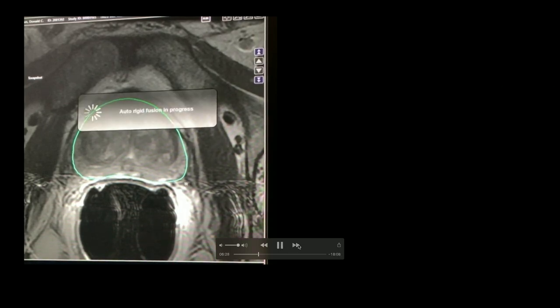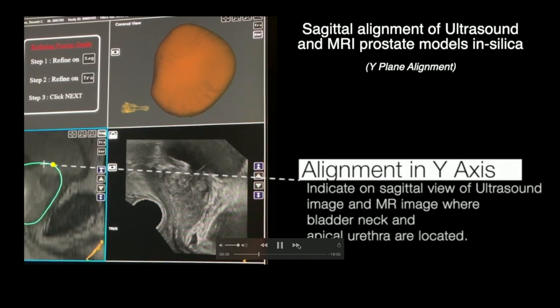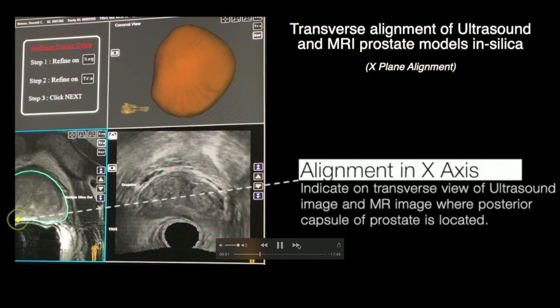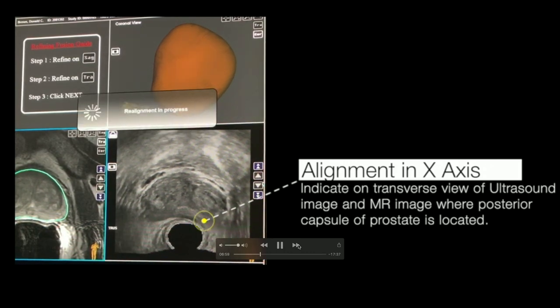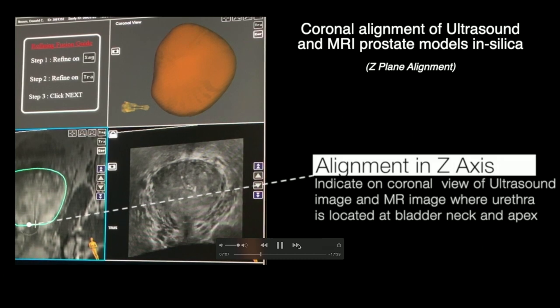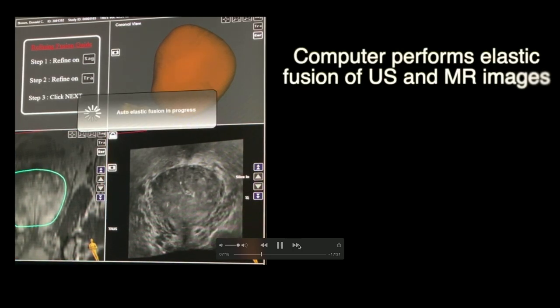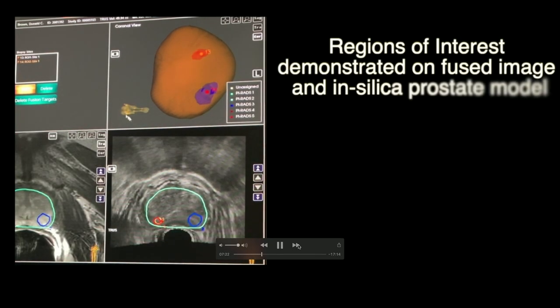Once you have it lined up, you tell it in X, Y, and Z space where the alignment of both the MRI model and the ultrasound model are. There are a number of different anatomic locations you can use. I find that using the apex—the urethra where the apex of the prostate is—and the bladder neck tend to be good for the sagittal alignment, which is the most important one. You then use the posterior capsule of the prostate to get it aligned in the X plane. I also like to use the coronal view—using the urethra and the bladder neck to line it up in the Z axis. The computer then takes these two 3D models and lines them up.